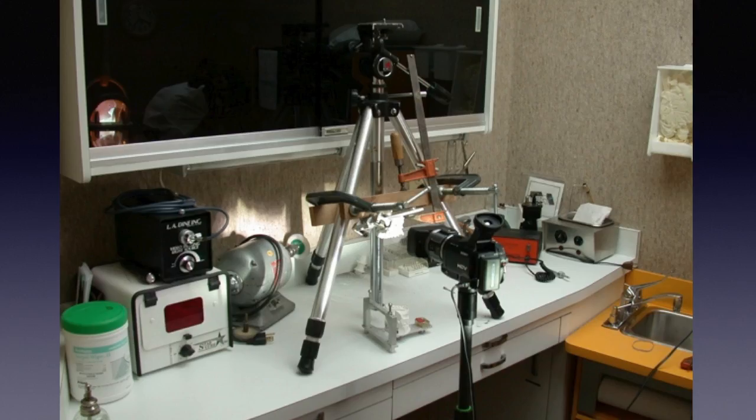This is our Rube Goldberg setup so that we could take movies of what the ball in the articulator does when the casts were moved from MI to CR. These are 8 different patients chosen at random, simply the last 8 patients for whom one of our study club members had mounted casts.